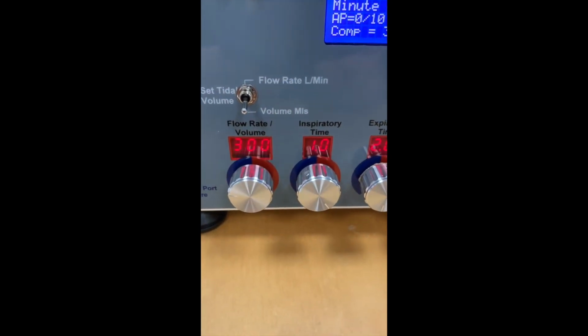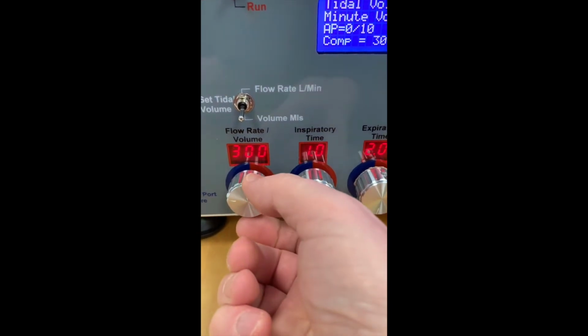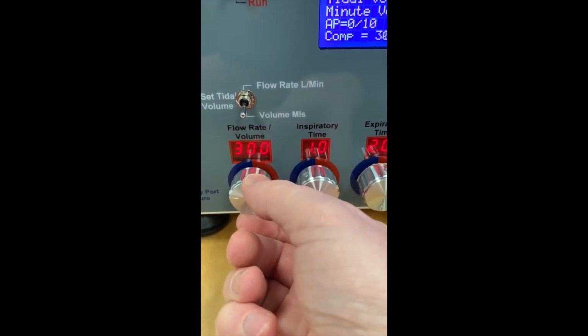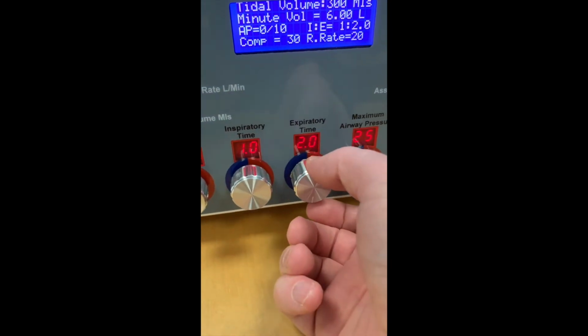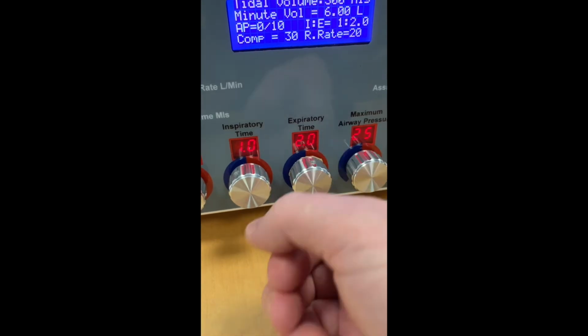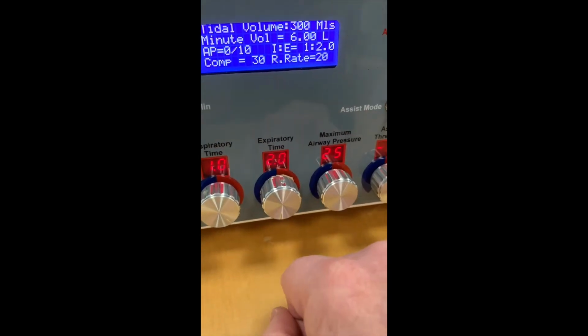We simply work from left to right on the control knobs. The first one is the volume control, so we set that to 300. Second one is inspiratory time, we set that to 1 second as our default inspiratory time. And we've got a 2-second expiratory time for a respiratory rate of 20 as shown on the screen and an IE ratio of 1 to 2.